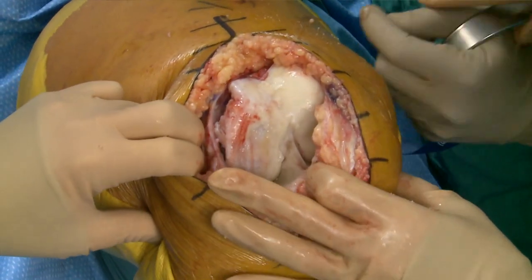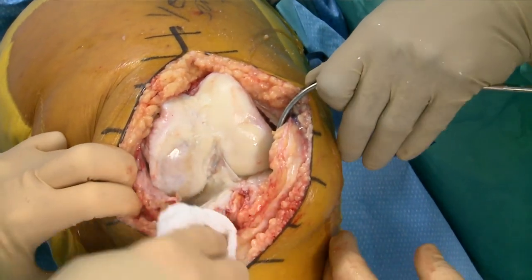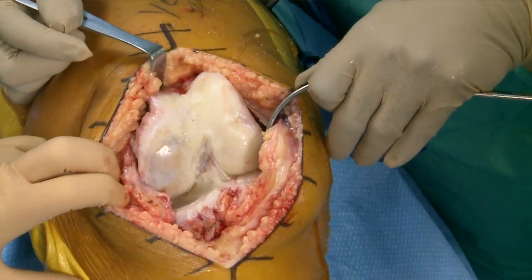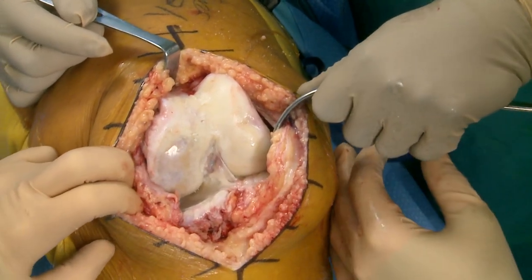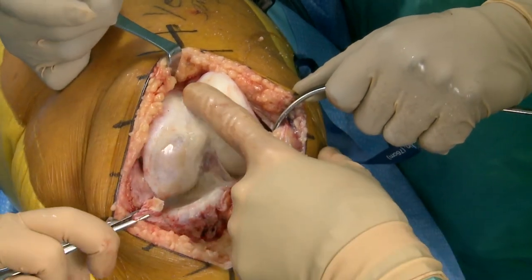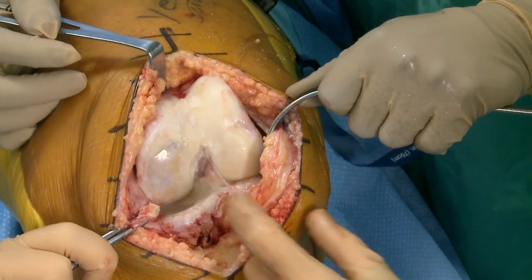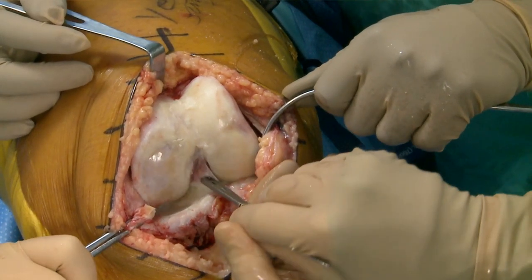Now we'll get on to the meat of it. We can see mostly medial disease; the lateral compartment looks good, no blister on the lateral side, a little bit of patellofemoral disease. Some surgeons that are enthusiastic about unis would have said this would be a good uni candidate — but it's not too late... yes it is, for me.